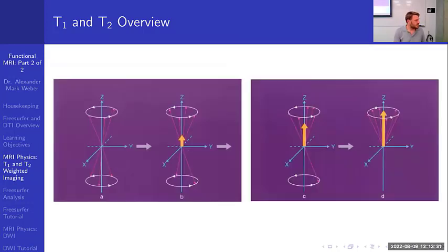A quick question. Absolutely. In diseases that have cerebral demyelination, is that something you'd see in the T1 and T2 images? Yes, very likely. They're not tissue specific, so I'm not 100% sure how that's going to end up looking, but clinicians use T1, T2, and something called FLAIR, which is T2, but water appears dark, for reasons I won't go into today.